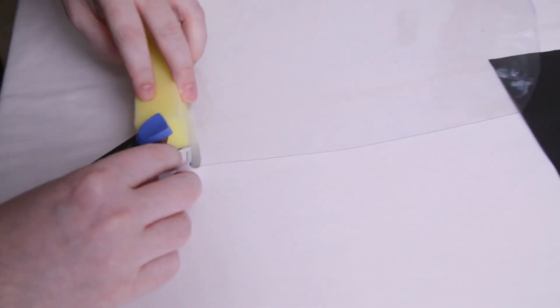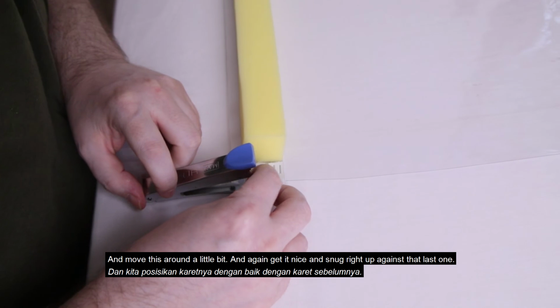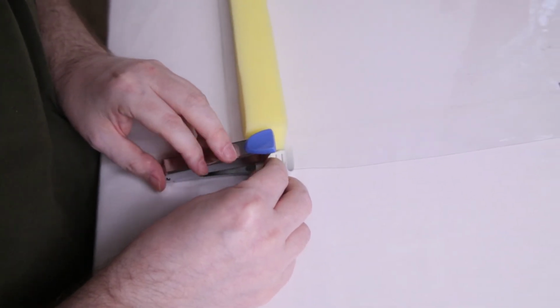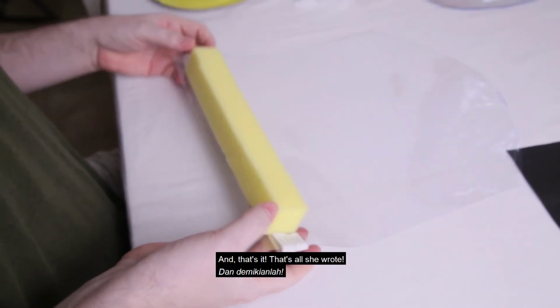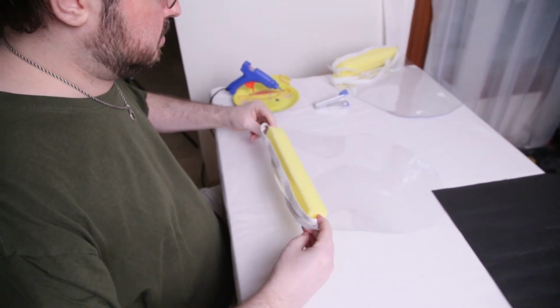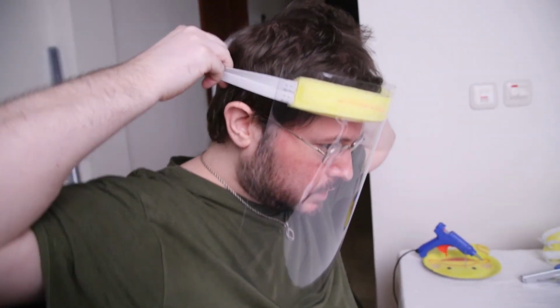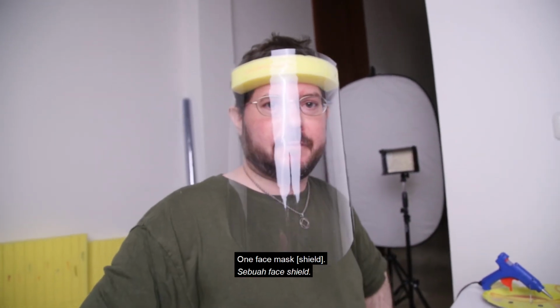So I'm going to move this around a little bit. And again, get it nice and snug right up against that last one. And that's it. That's all she wrote. We just flip these over. And Bob's your uncle. There you go. One face mask.